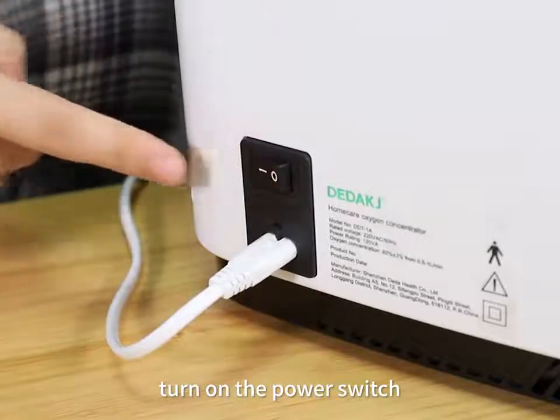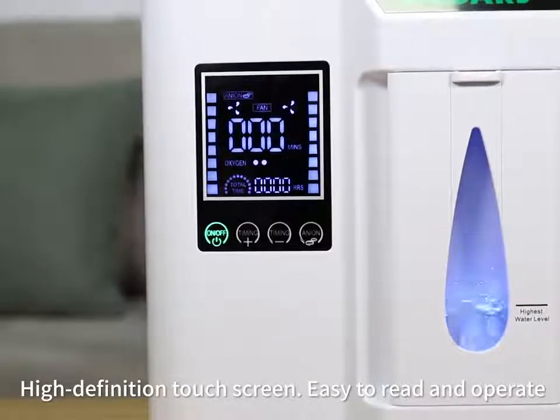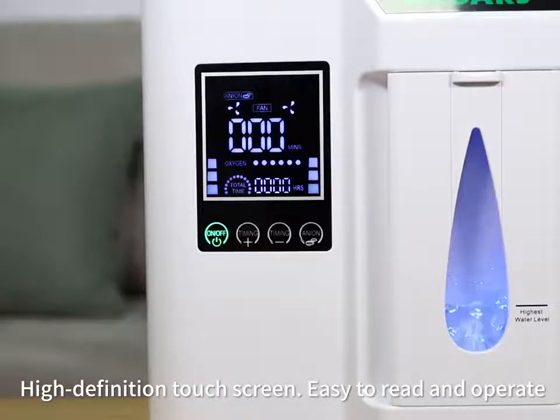Turn on the power switch. One button start. High definition touch screen, easy to read and operate.